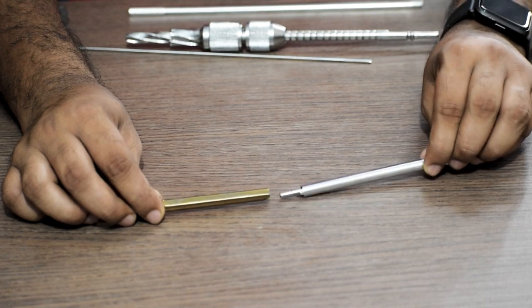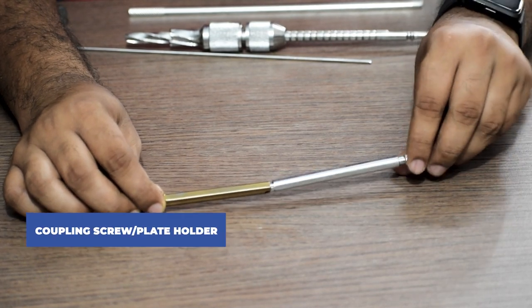After this, we remove the guide wire as well and then connect the coupling screw or the plate holder.